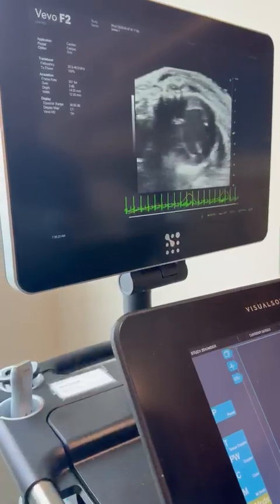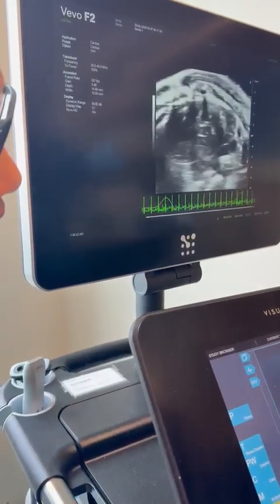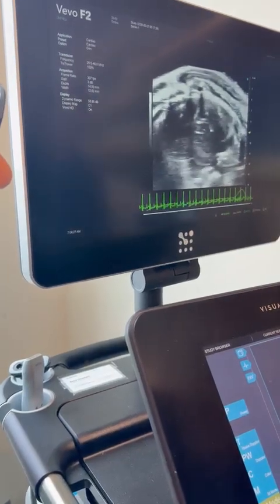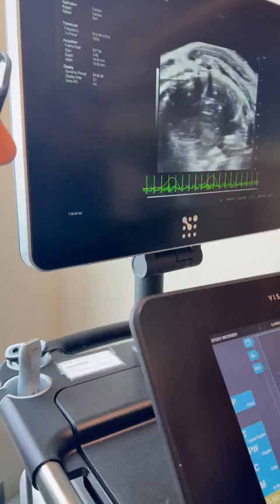And you're going to turn it pretty far. So we're going to bring the animal towards us. We're starting to look for that upside down Y. Start to come in, keep coming. That's the end. And this stage is hard to move, so I'm just going to bring this down and then we'll go back.